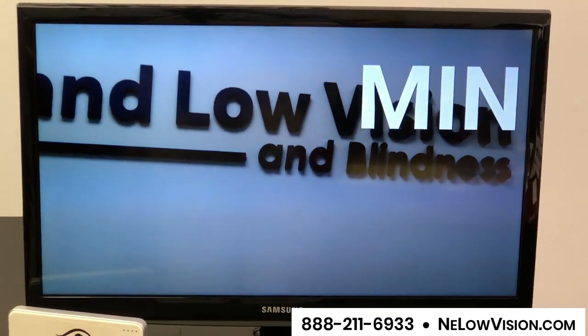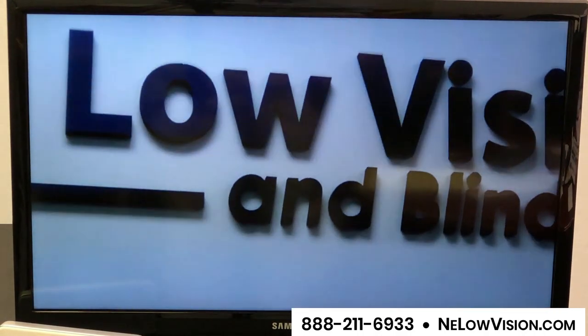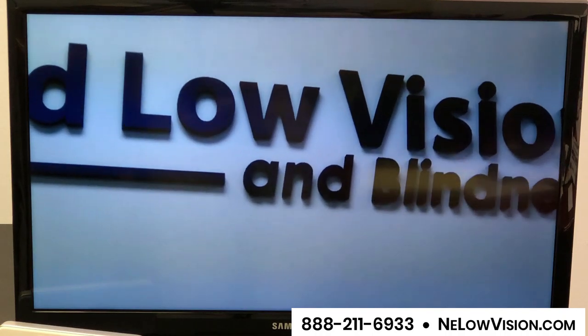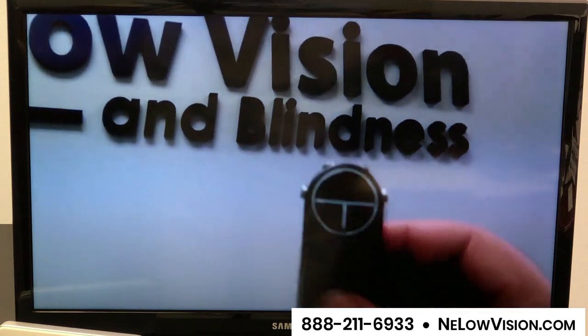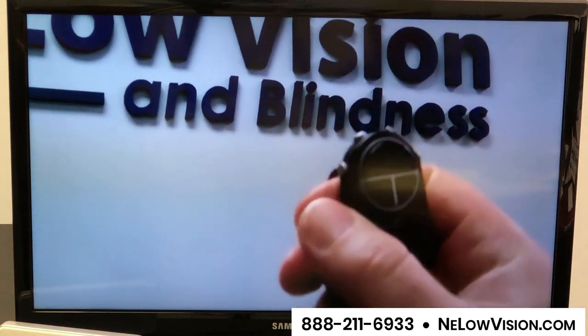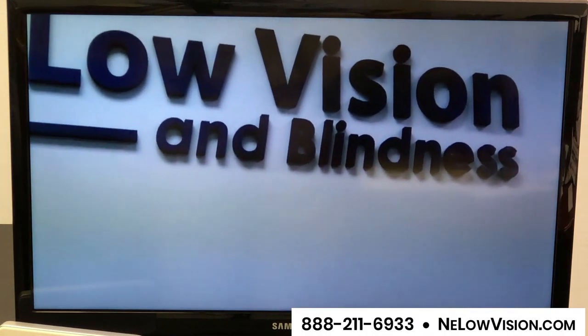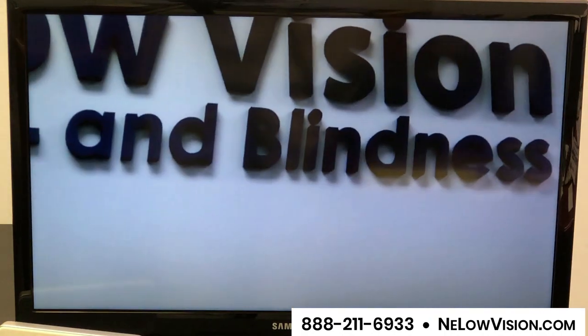It goes to about 10x or 12x with an extra lens that comes with it, and you can easily move in and move out on whatever it is that you're viewing. I can also use this remote control — it connects to the glasses via Bluetooth — and I can use it for increasing and decreasing the magnification just as I was doing on the glasses itself.